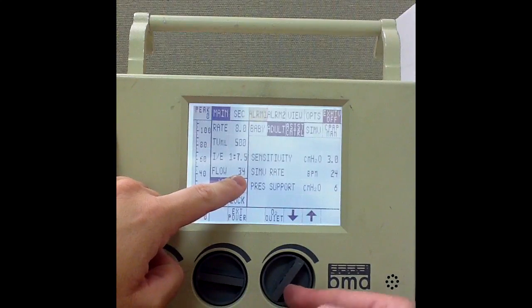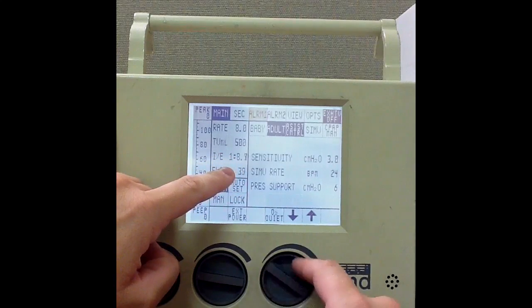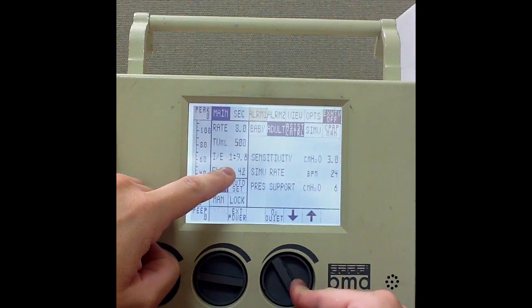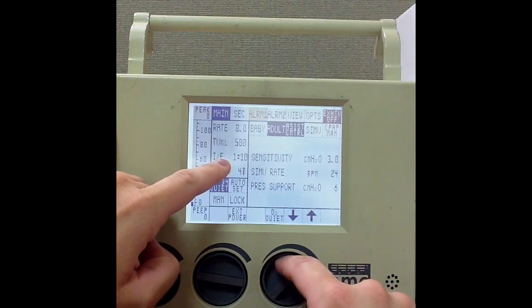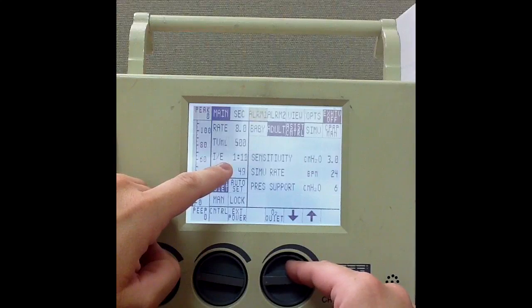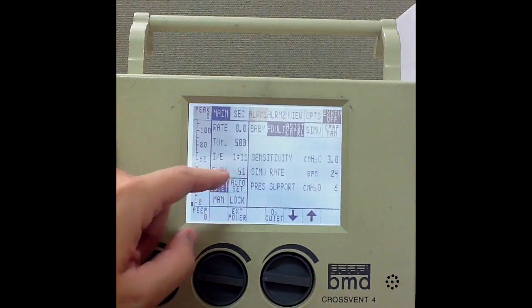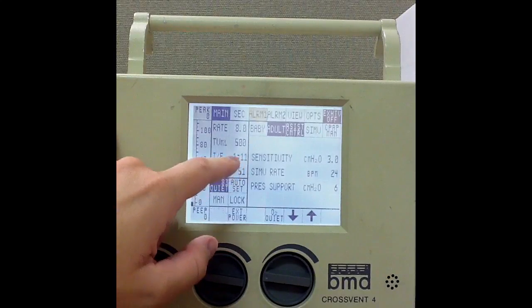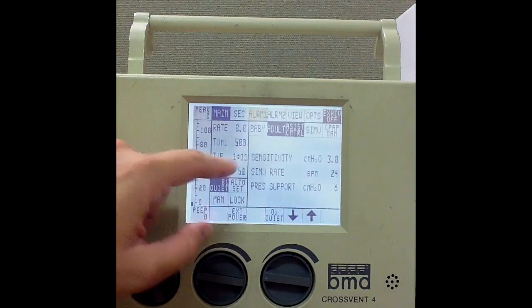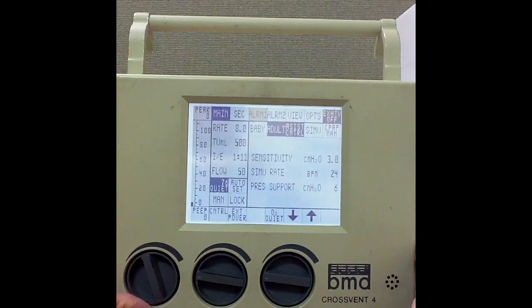That I to E ratio should become larger as my flow increases, and you can definitely see that that's occurring. We're now in the mid-30s, going up on the flow — and 50 liters per minute. Clearly that gives me an interesting I to E ratio, and in reality we might want to consider adjusting that a little bit. But we'll stick with that since this is more about just interfacing with the ventilator.